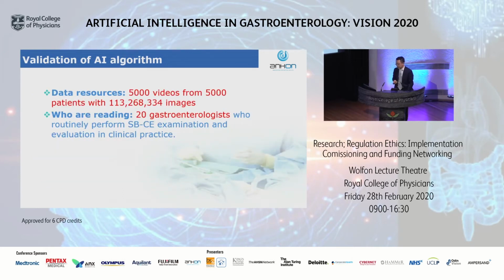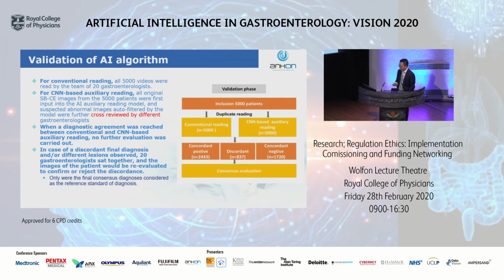We used 5,000 videos from 5,000 patients with more than 113 million images to validate the AI algorithm. We used 20 gastroenterologists who routinely perform small bowel capsule endoscopy examination and evaluation to do this validation. So here I can show you how we did the validation.